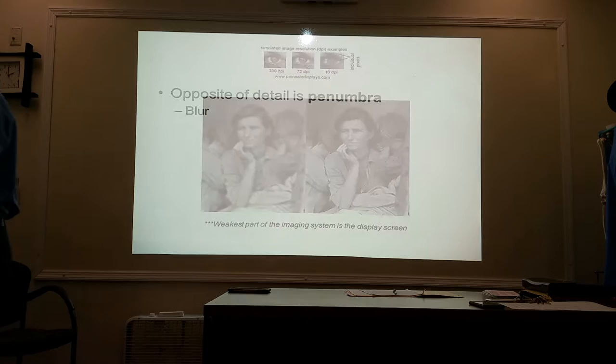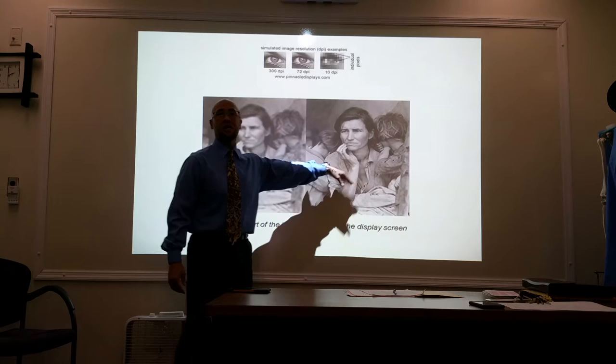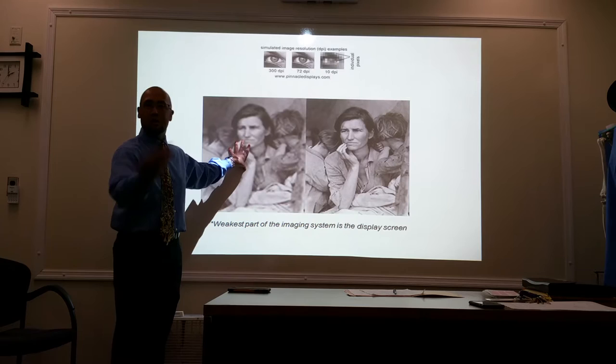You've got two examples here. This is great detail. This is loss of detail, or what is this called? Penumbra. Blur or penumbra.